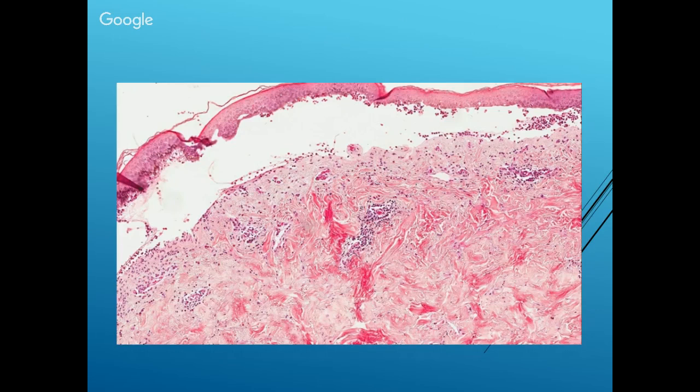It is below the, so it is at the dermal epidermal junction. So in the first one you saw the split was within the epidermis. So that is an intraepidermal vesicular-bullous disorder. And if you see the split that is at the dermal epidermal junction, that is the prototypical part. So we call it subepidermal vesicular-bullous disorder. So that is how you're going to approach any vesicular-bullous disorder.